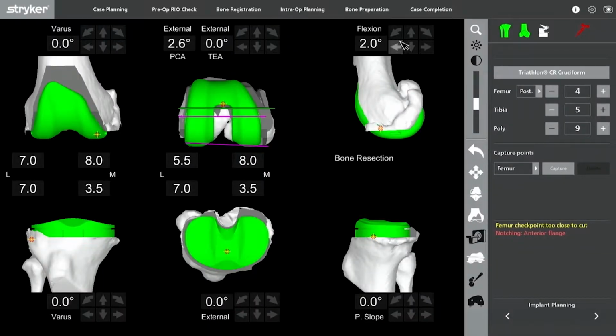Intraoperatively, you can adjust and change those cuts and customize it to each individual patient's ligament tension, and it kind of results in perhaps a more natural feeling knee. The standard and conventional systems, which work well, kind of make the same cut for everyone. Everyone gets the same alignment and varus valgus and flexion extension, and everybody's probably not really the same. The ability to make these sometimes subtle adjustments really can result in a better feeling knee.